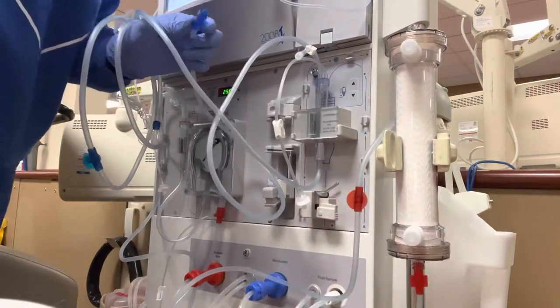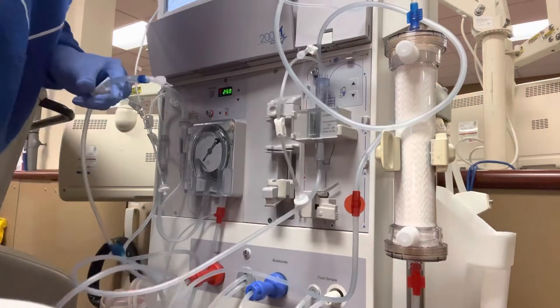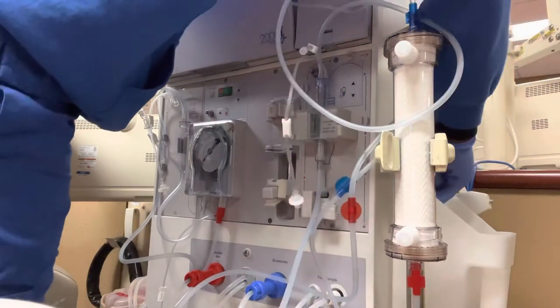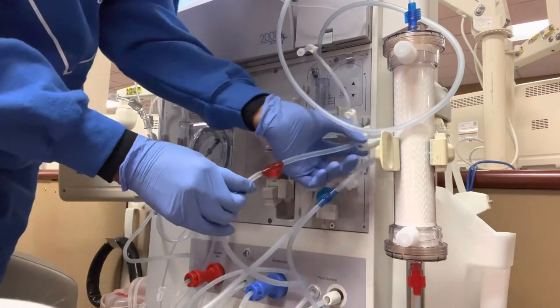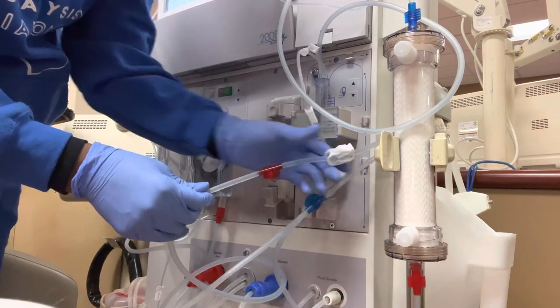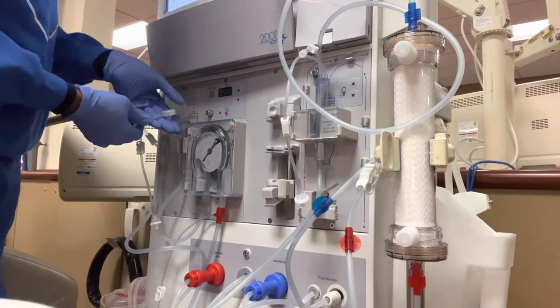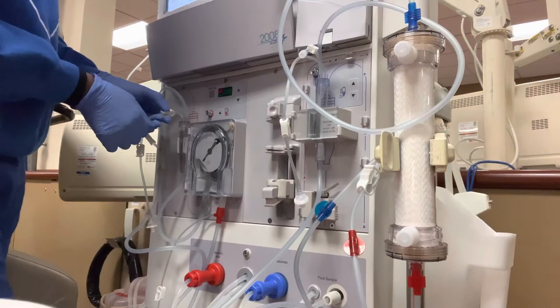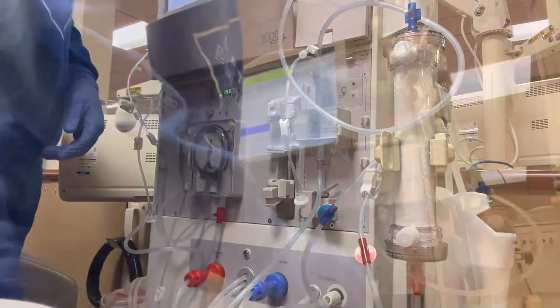The goal, I know this is a repetitive video, but I don't care. I want you to do it as you go. And you won't forget much as you do it as you go. You see, my big venous clamp is left open because the venous is primed by the pump and the arterial is primed by gravity. So that is what's happening. So now I'm going to clamp my arterial and fill my arterial chamber with the arterial tail. And then I'm going to clamp it back. Now, set my blood pump to 150 and prime.